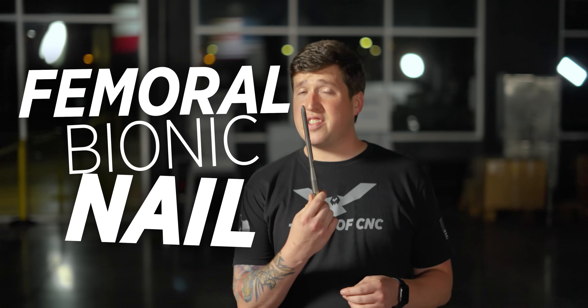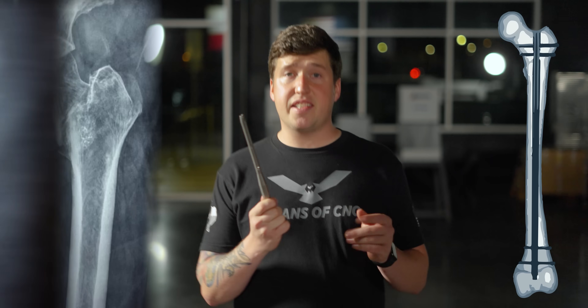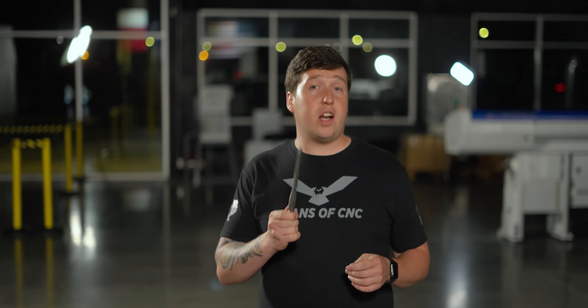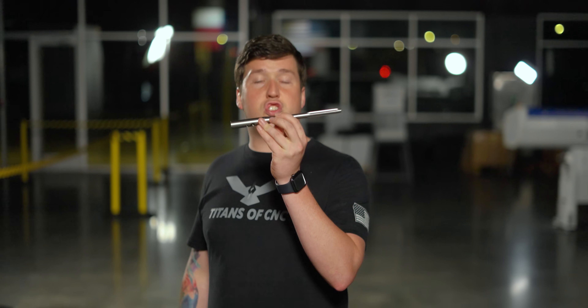The part we're making in today's video is a femoral bionic nail, and how this gets used in surgery is disgusting, but that's not what this video is about. This video is about showing you how with the right equipment, making a part like this can be extremely easy.